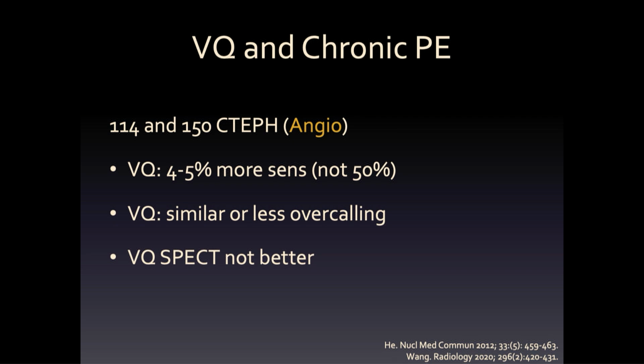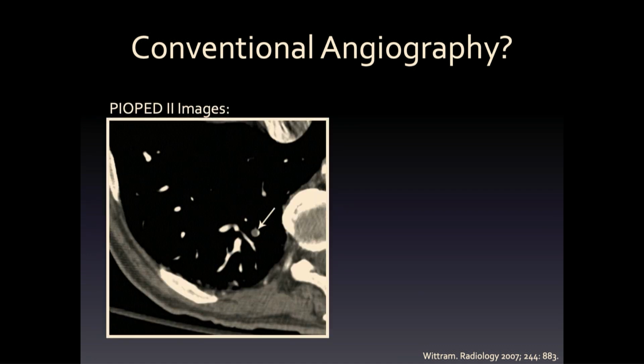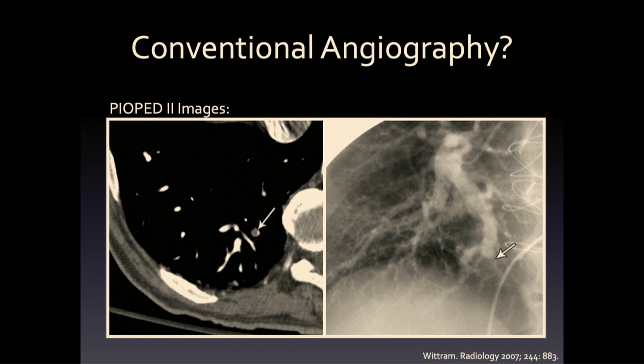Interestingly, SPECT does not make it better, probably because the 3D is just harder to read. So VQ is actually slightly better than CT. There is some confusion as to conventional angio, like our standard. This was a point of an early CT study.